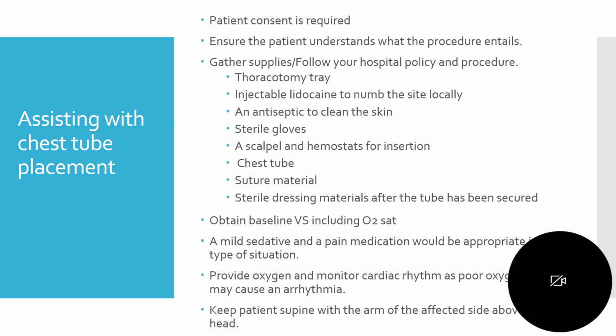And then keep the patient supine with the arm of the affected side above the head. That way it makes it easier for the physician to locate the area and insert the chest tube.